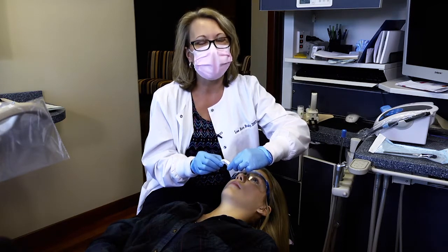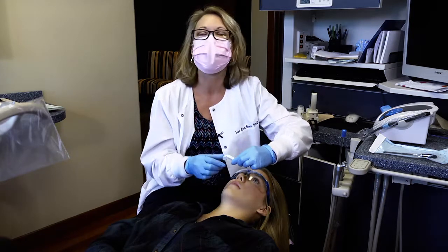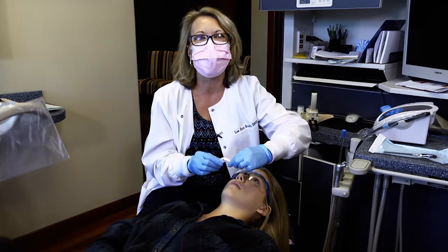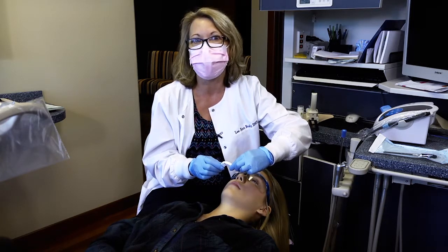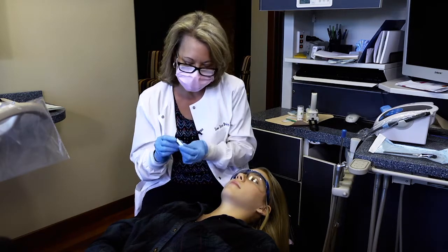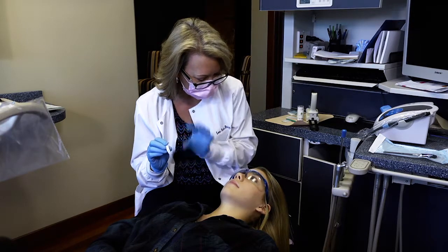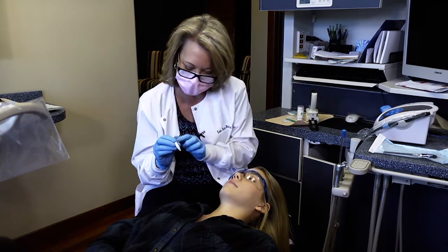What I'd ultimately like to make sure is that we don't have back teeth touching, and that I'm going to get even contacts both on the right side and the left side once the material is set. So now that we've tried this in, Jenna, I'm actually going to put a material in here that is the same stuff that we use when we take impressions of your mouth to get models of your teeth.